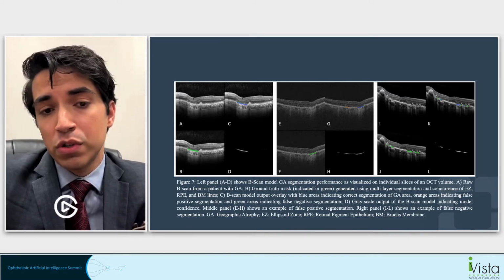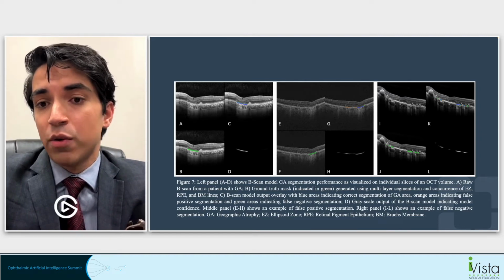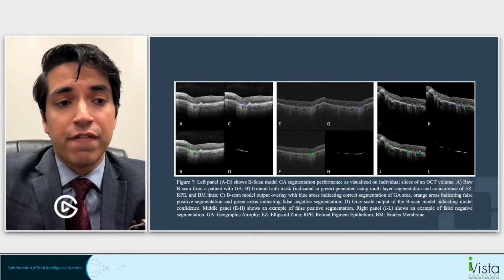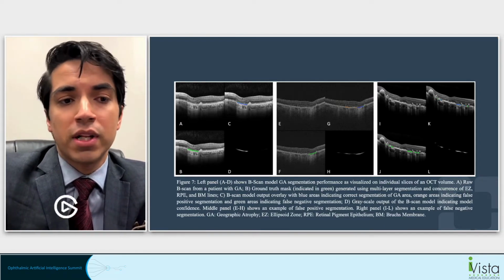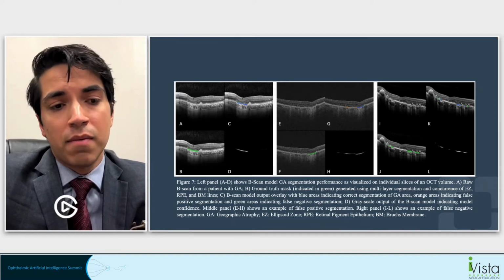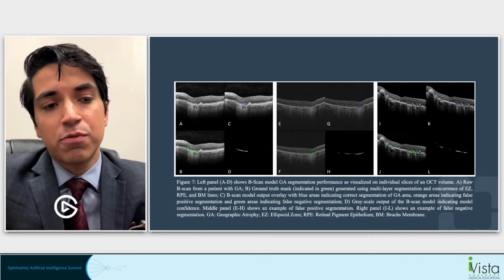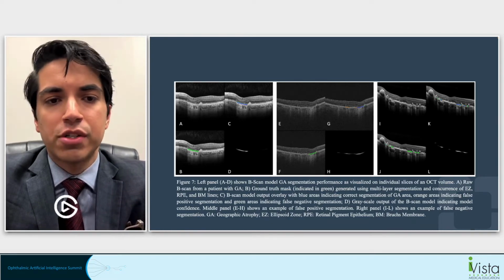Figure D shows the grayscale output of the model's confidence of exactly where it thinks GA is in that scan. It seems to do a pretty good job of identifying where exactly it's marking, and it's very explainable. As some of the talks before have highlighted the use of masks in training, instead of using just a black box, you have more explainable results about where exactly the model is looking for features.